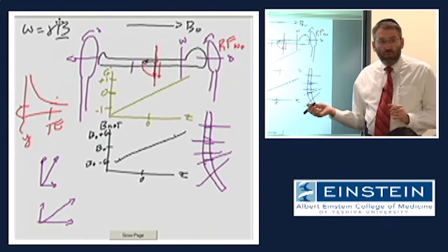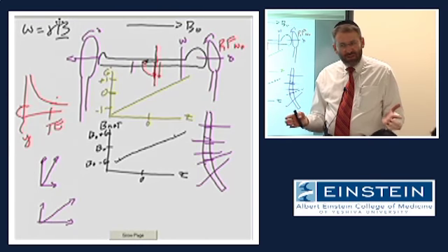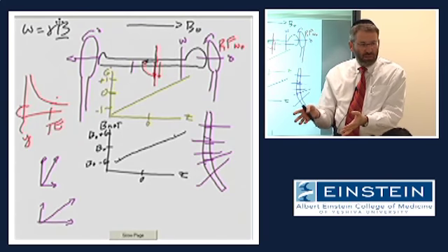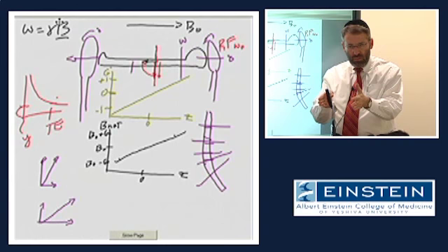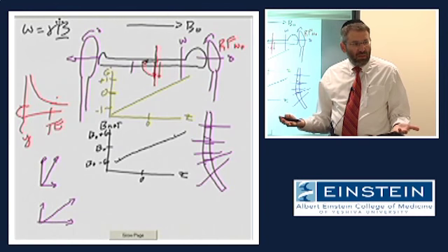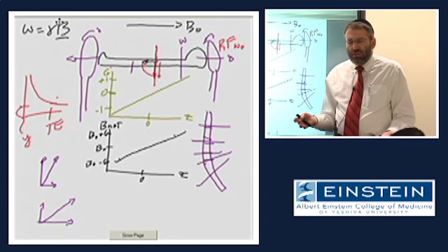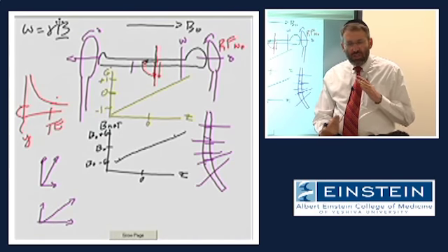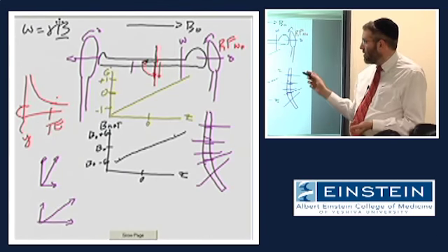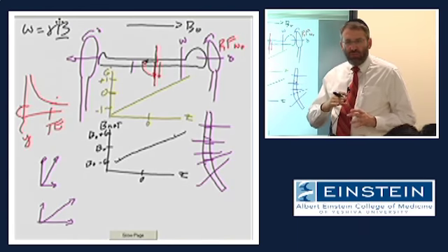This becomes extremely important, for example, in fetal imaging. Regular postnatal patients are great because you can lay them on the table, position them carefully, slide them in. They hold still or they're strapped down or under anesthesia or whatever. And imaging them in these sort of orthogonal coronal, sagittal, and axial planes is easy. But when you image a fetus, especially one that is young enough to still be moving around, it's totally unpredictable. And the ability to image essentially in any plane is what allows you to generate images that are what we expect in terms of sagittal, axial, and coronal images relative to the position of the fetus.